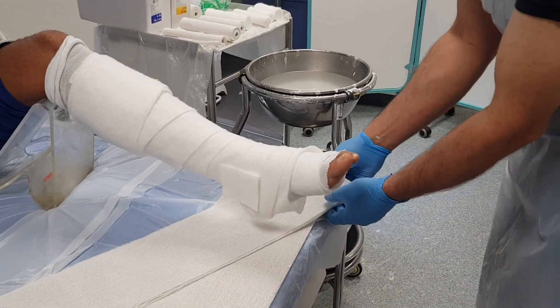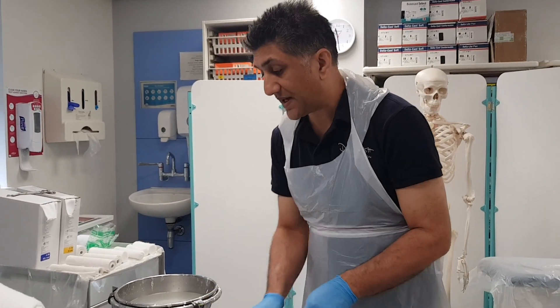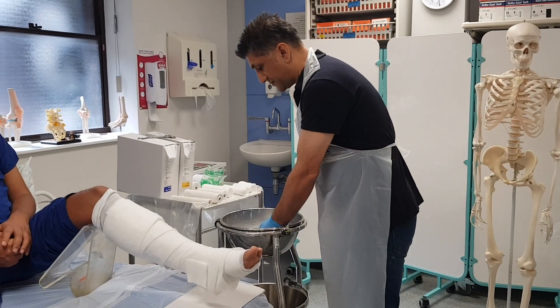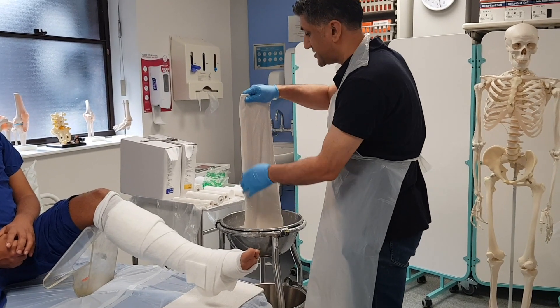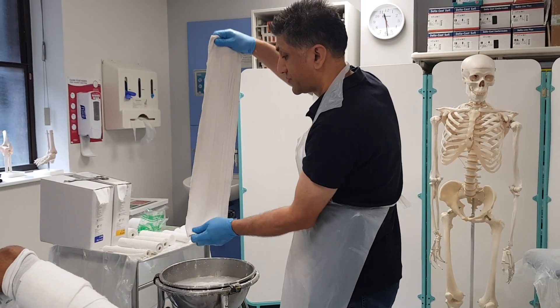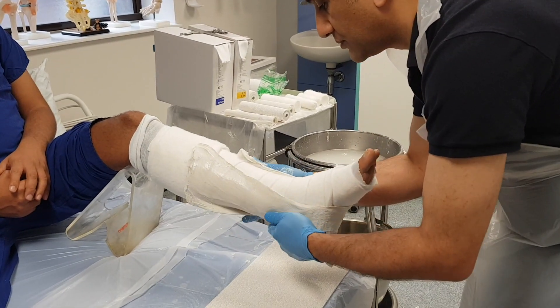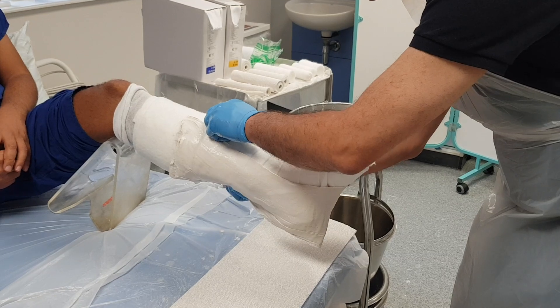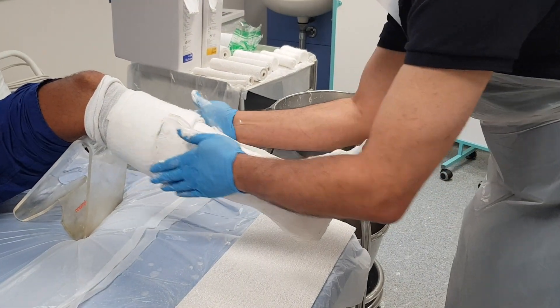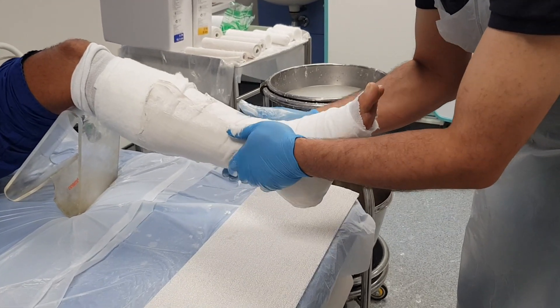I'm going to put on my stirrup first, and the reason is that if I try to apply the back slab to the back of the leg first it's just going to fall off with gravity, but the stirrup should stay on. I'm going to get it wet, make sure it's nice and soaked, squeeze off the excess water, and that's going to go underneath the foot and around the sides. I don't want them to meet at the front because then that would be a complete plaster and there would be a risk of compartment syndrome if there was any swelling. I'm using my palms to smooth this out.